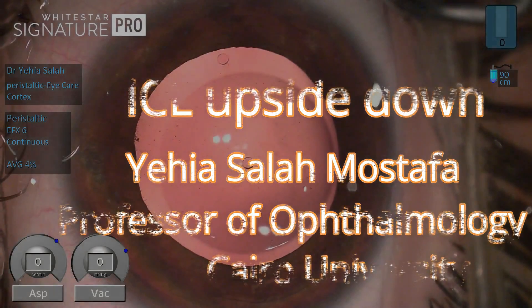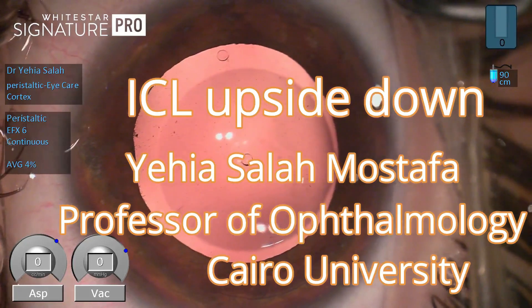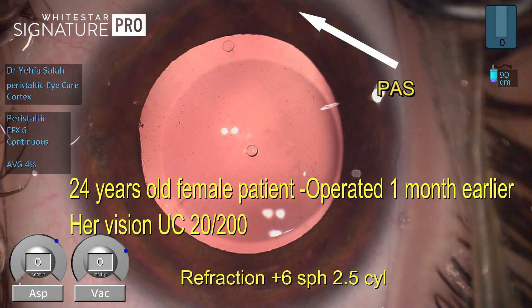This is a case of a young patient who was operated a month earlier with ICL implantation for correction of minus 5 myopia.